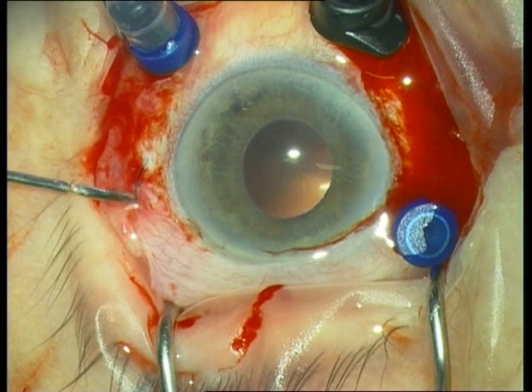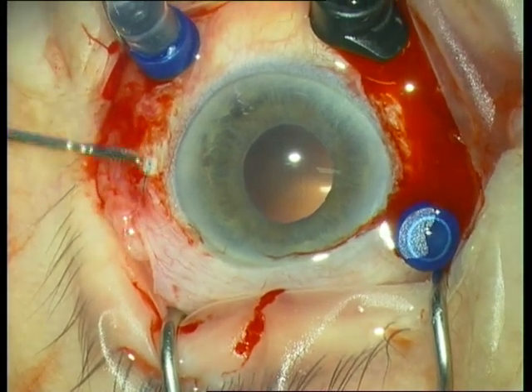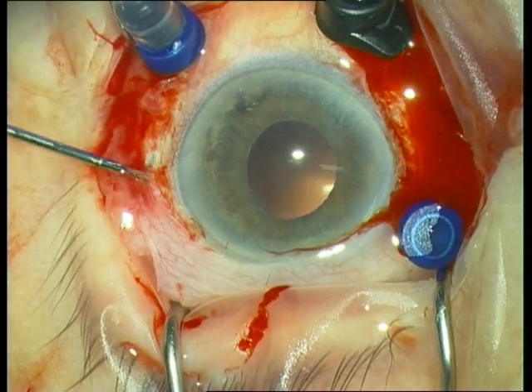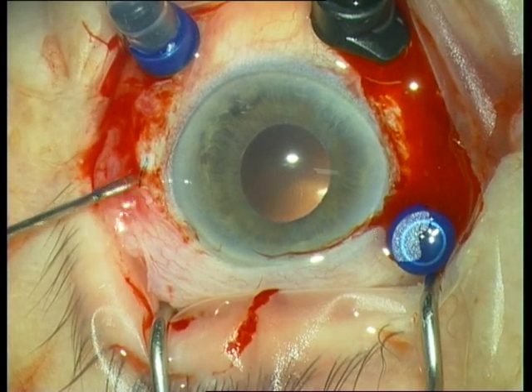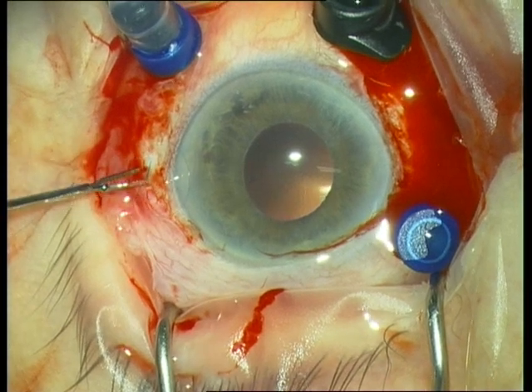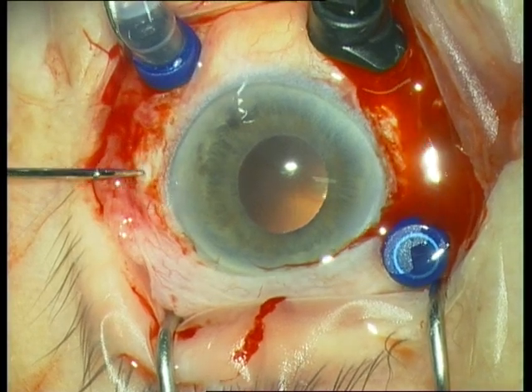Then we push the haptic back into the vitreous cavity using again the serrated jaw forceps. On the top right you see the chandelier light from Synergetix, which sits very nicely in the sclerotomy.